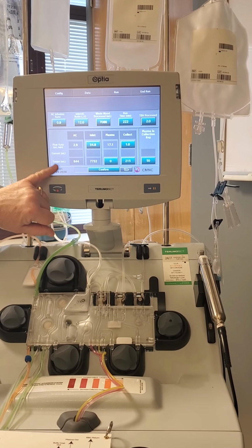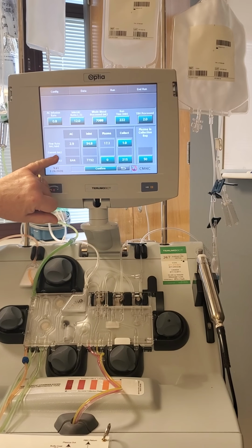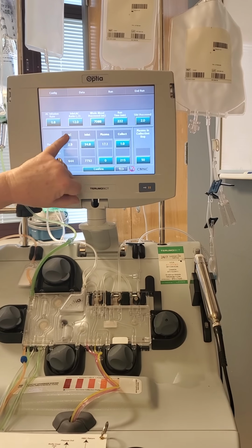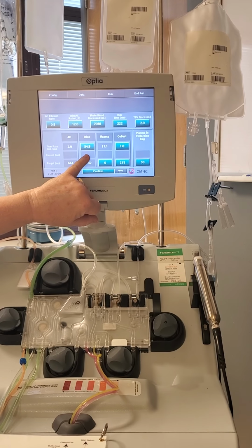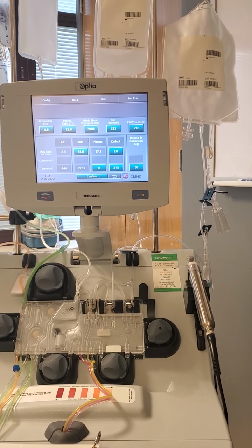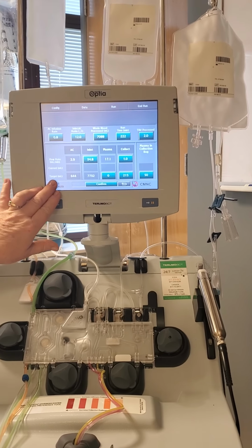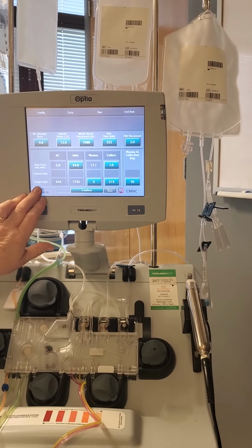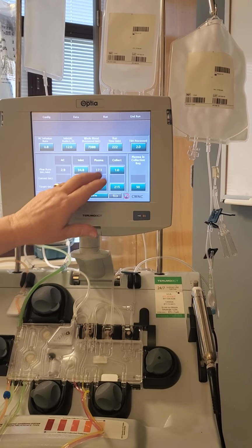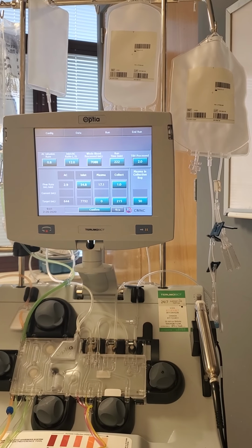Underneath the flow rates is a line of current volumes, which is blank because we're not running yet. So this will show how many mils have passed over the AC pump, the inlet pump, the plasma pump, and the collect pump up to this moment in time in our procedure. But nothing's there yet because we haven't started. What we are showing is by the end of the day, when the collection is finished, after 222 minutes, these are the volumes that each of our pumps will have pumped.